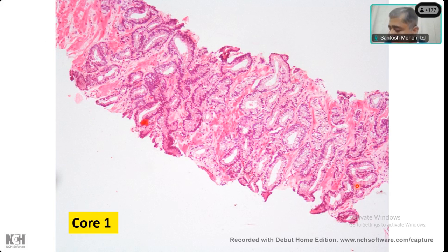Shivani, you think it's cancer? It's hyperplasia. You think it is hyperplasia. Why do you think it's hyperplasia? Are the lumen of the glands rigid or undulating? Stellate lumen?